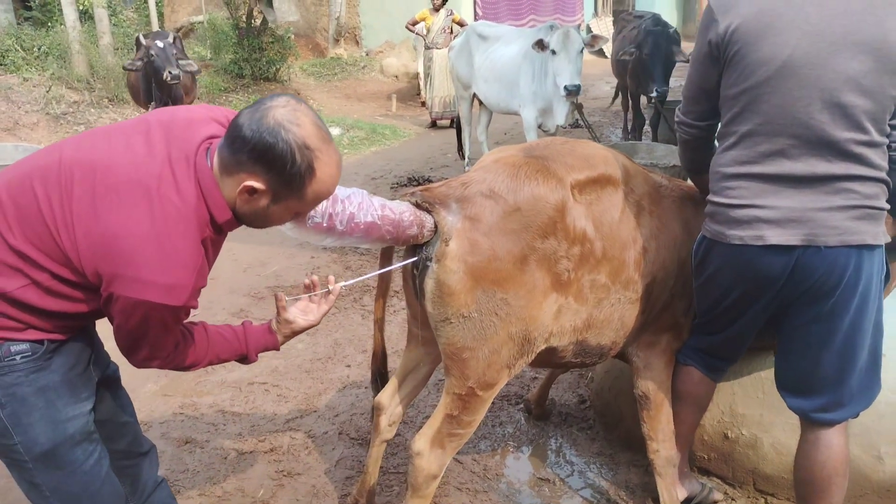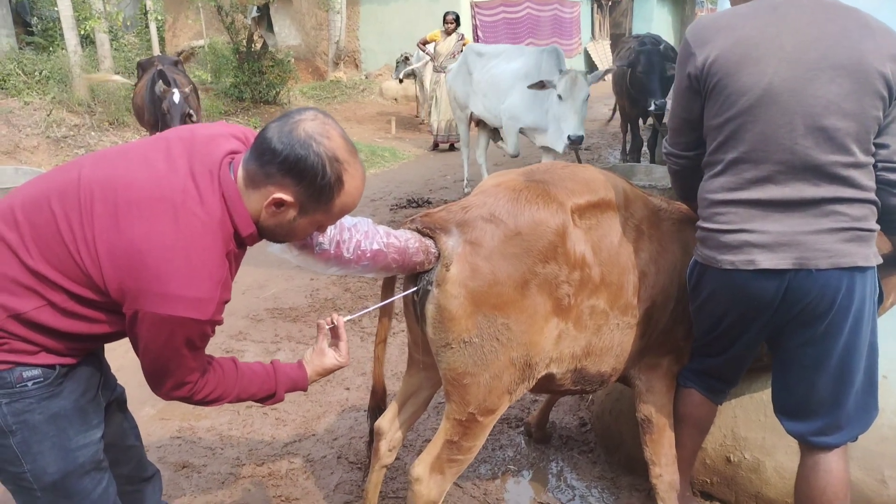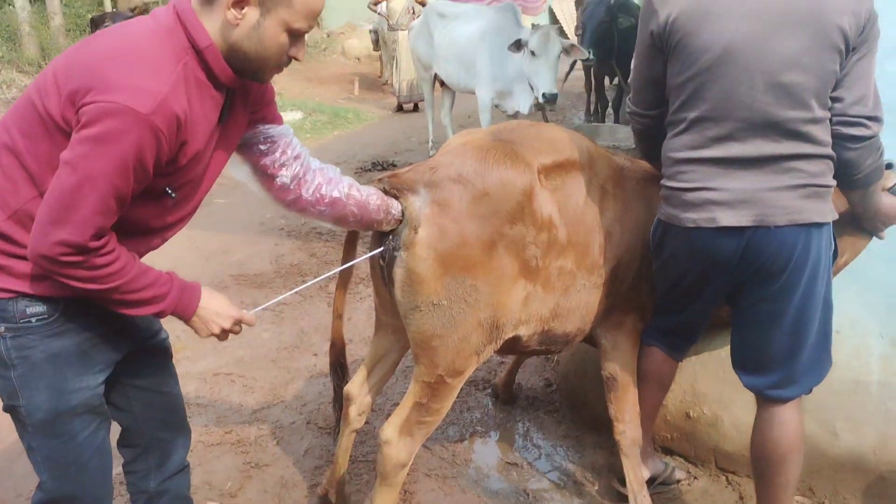I have to push the gun in order to complete the AI.